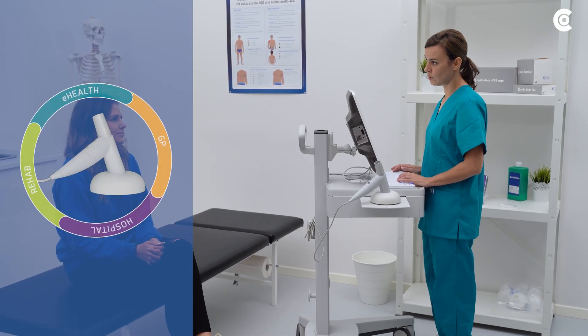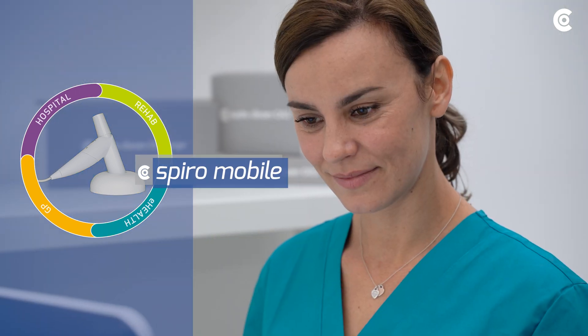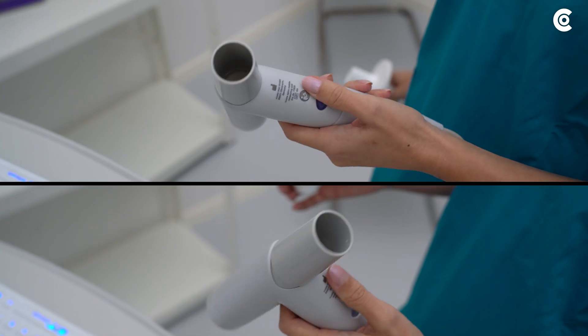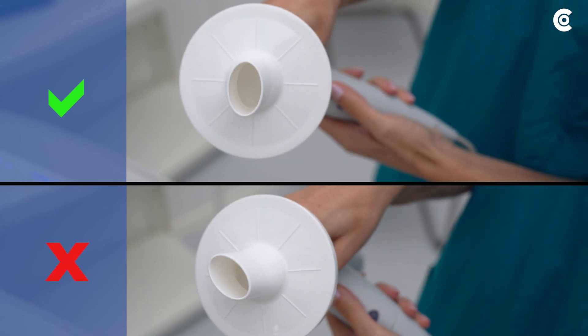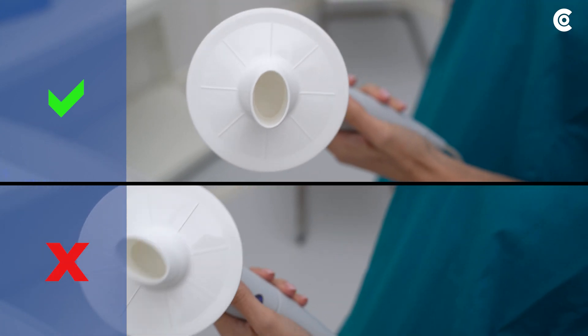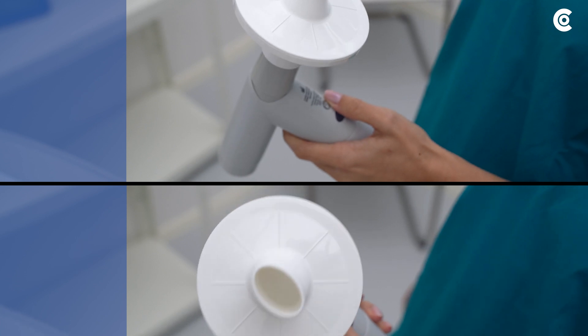The following video shows you how to handle CustoMed SpiroMobile correctly and which user errors you should try to avoid. Make sure to place the CustoSpyroProtect correctly on the SpiroMobile. When placed incorrectly, the patient will not be able to breathe.